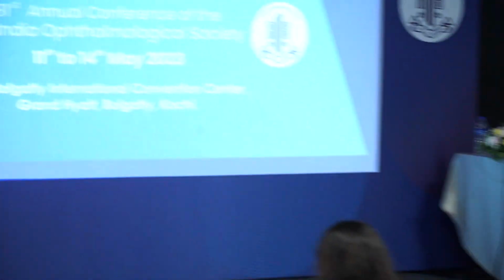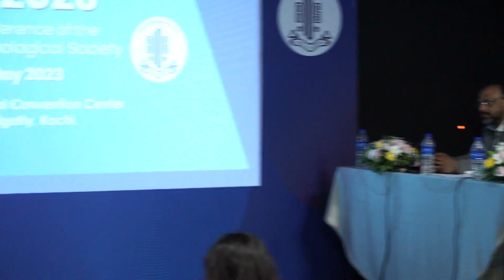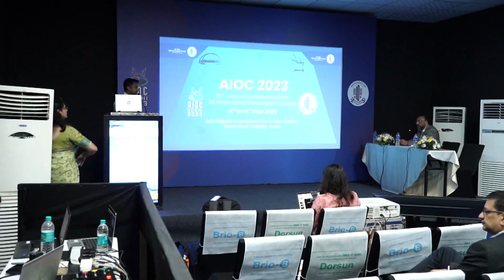Another small thing: do you prefer to do it under the flap? That's a good question. My preference is always with the flap. They have not said it is not possible. Just that above 2 diopters, if they are hypermetropic above 2 diopters, they are saying that trans-PRK also can be done. Yes, it does work.